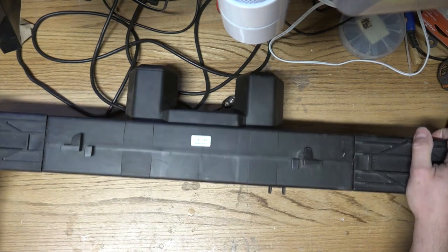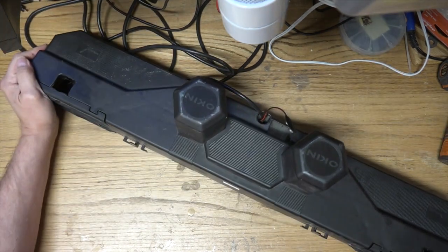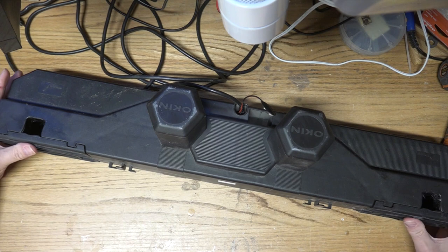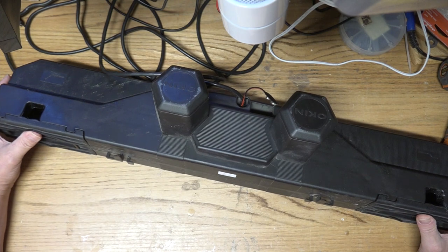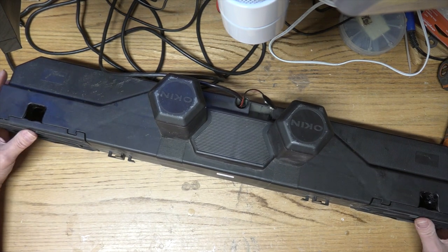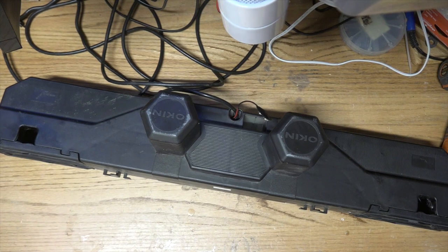Well, actually, this is the control unit for a hospital bed. My mother-in-law, in her last couple of years, was having orthostatic breathing problems because of her CHF, and it was suggested that maybe we get a bed that could elevate nicely, for her to sit up a little bit more when she sleeps, so it would help with the breathing. So we got one off of Craigslist. We found a quite nearby hospital bed. It was quite reasonable. So this is the power unit off of that hospital bed.